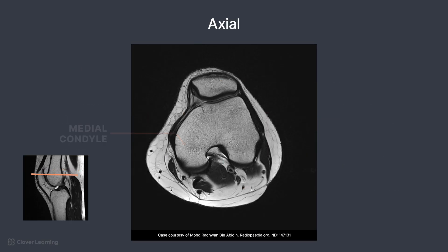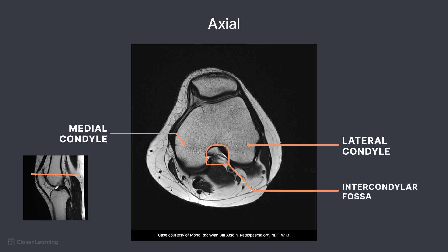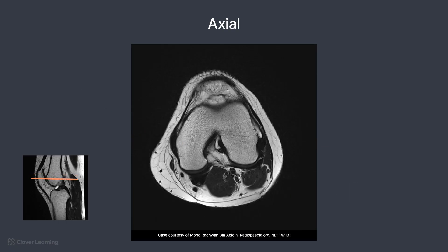Here, the medial condyle, lateral condyle, and intercondylar fossa can be seen, along with the medial retinaculum. Anteriorly, the patellar ligament is demonstrated as a dark structure. Remember, ligaments and tendons appear dark on MRI images.